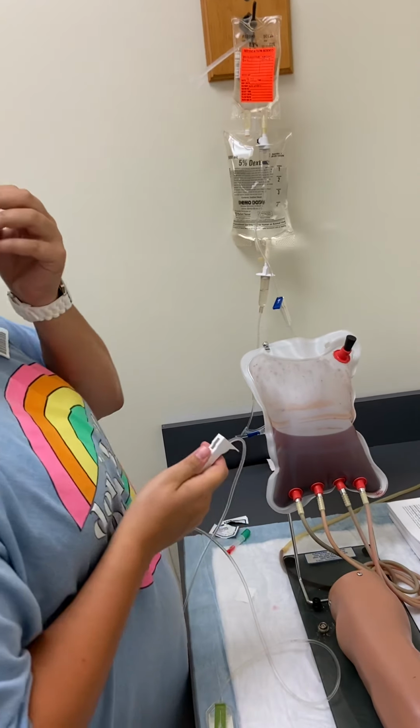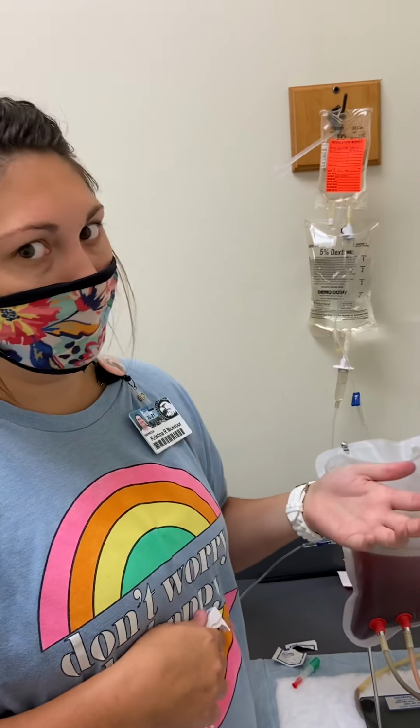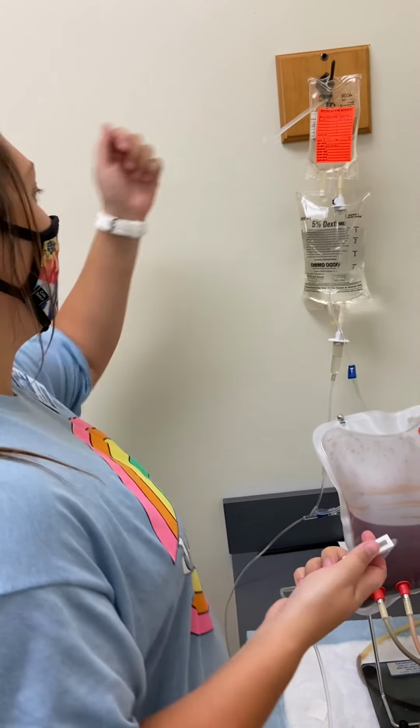So first I'm going to count for 15 seconds, and it's like 4.25, so I'm just going to try to get 5 drops in 15 seconds.